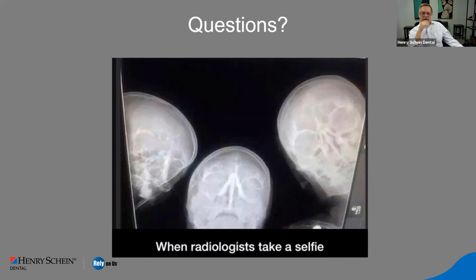So, great, thank you. If the sella turcica is greater than 9 millimeters, does that indicate acromegaly? Not necessarily. The size of the sella turcica is typically about the size of a dime. I guess it depends on the individual, but if we do see a sella turcica that's larger than the size of a dime and has a hydrostatic appearance, we will send that patient on for additional imaging.